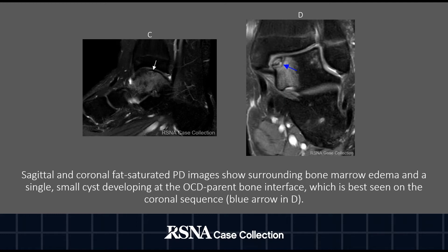Sagittal and coronal fat-saturated PD images show surrounding bone marrow edema and a single small cyst developing at the OCD parent bone interface, which is best seen on the coronal sequence, denoted by the blue arrow.